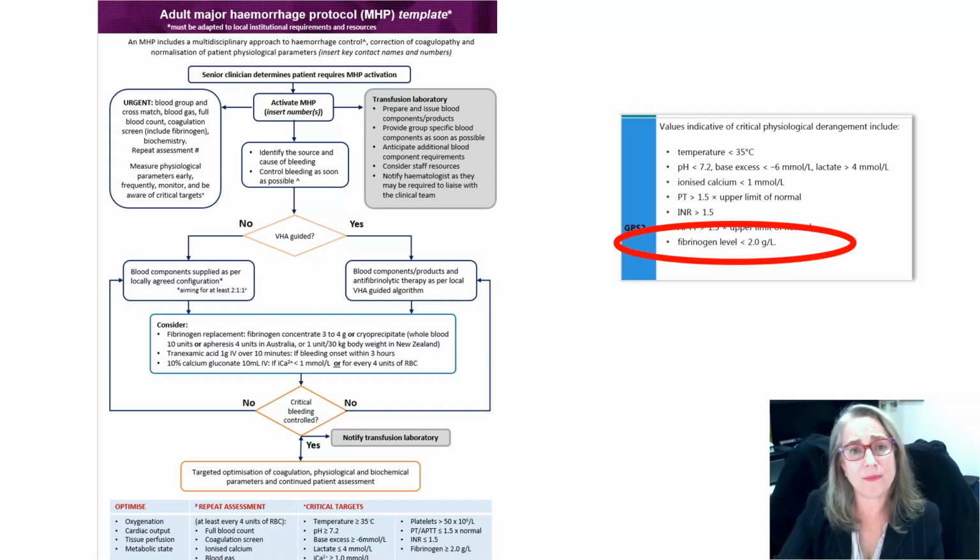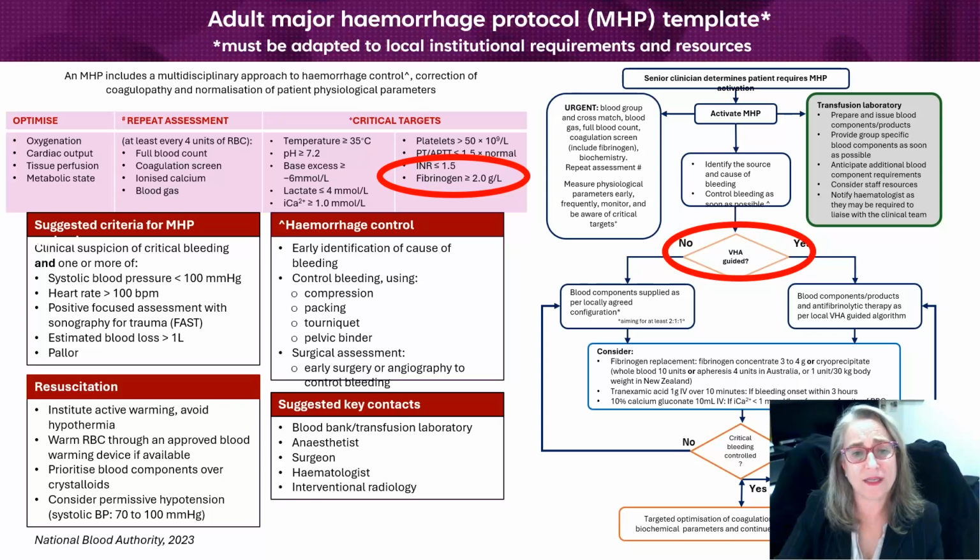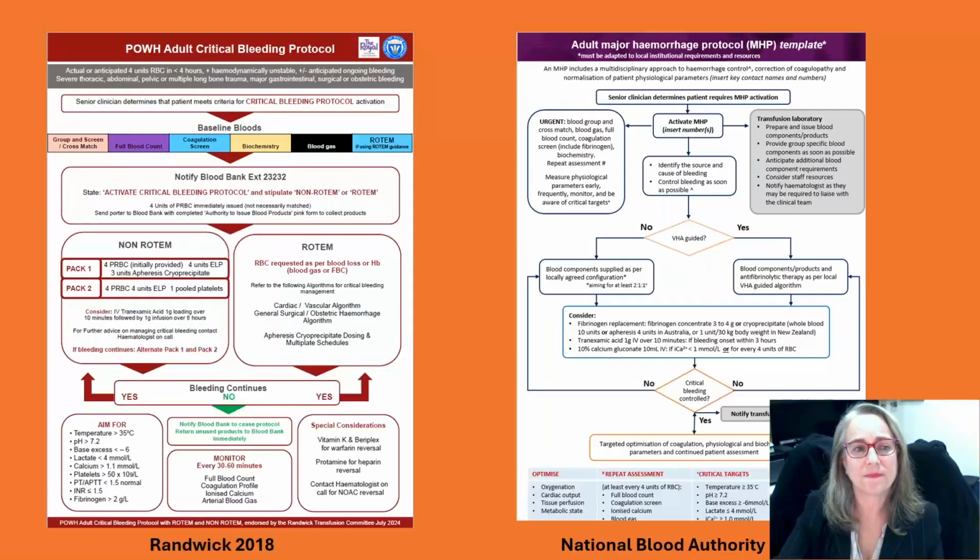And the more detailed slide that the NBA has and would like us to use for education is this slide. So it's got on the right hand side the protocol I just showed you, and on the left hand side a little bit more about what to do when a patient's bleeding, how to resuscitate them, and things that you've already been over.